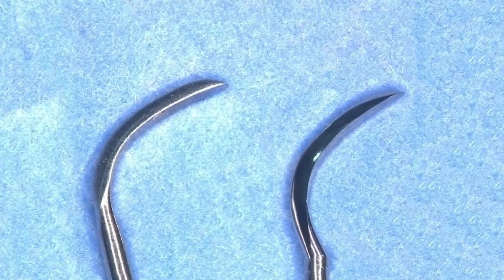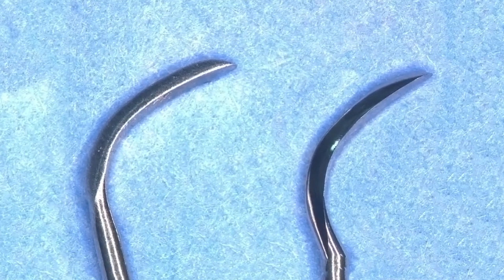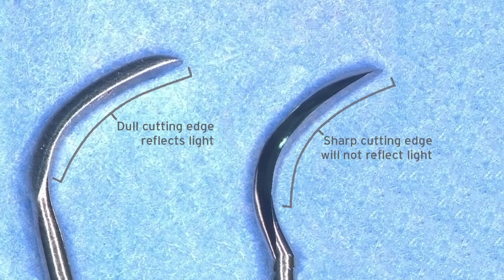To visually inspect a blade, hold the instrument under a light and rotate the instrument until the edge is facing the light. A dull cutting edge will reflect light when it has become rounded from use. A sharp cutting edge will appear as a fine line that will not reflect light.